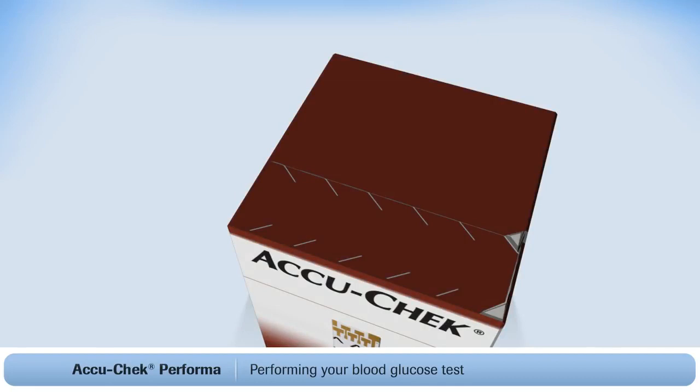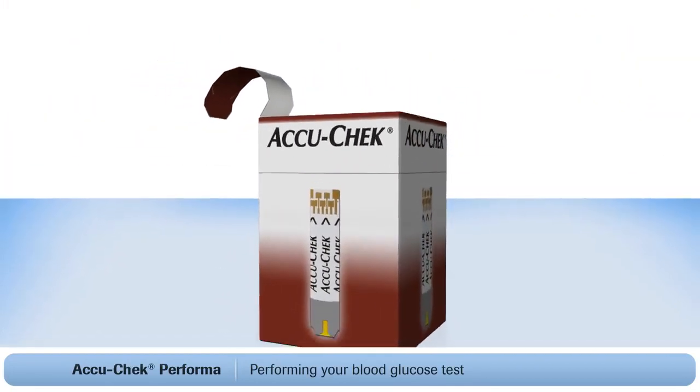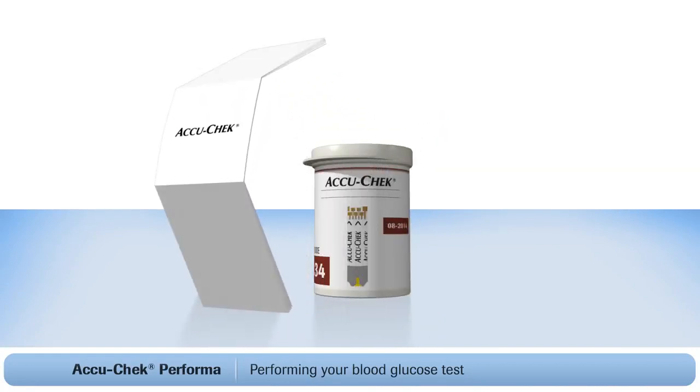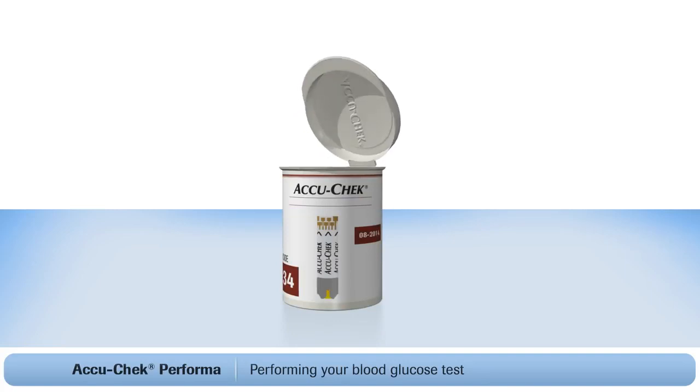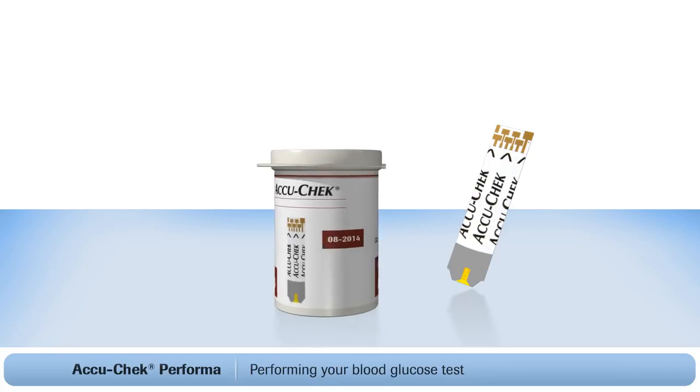Open the box of test strips. Just tear along the tab on the top of the box. Inside, you'll see some paper with technical information and a container of test strips. Take a test strip from the container and always remember to close the lid tightly. This helps protect the remaining strips. Always check the expiration date on the container. Do not perform a test with expired test strips.